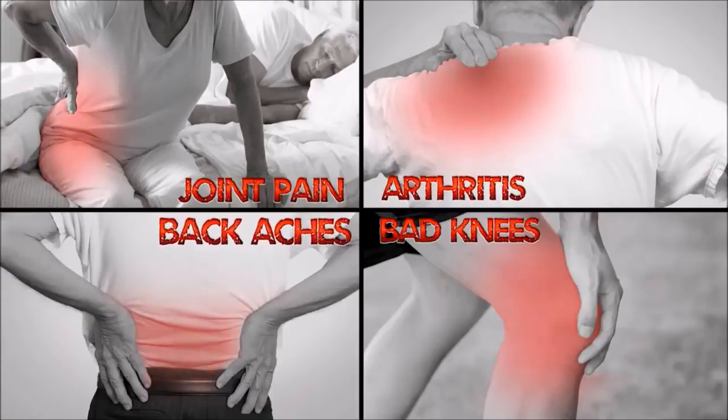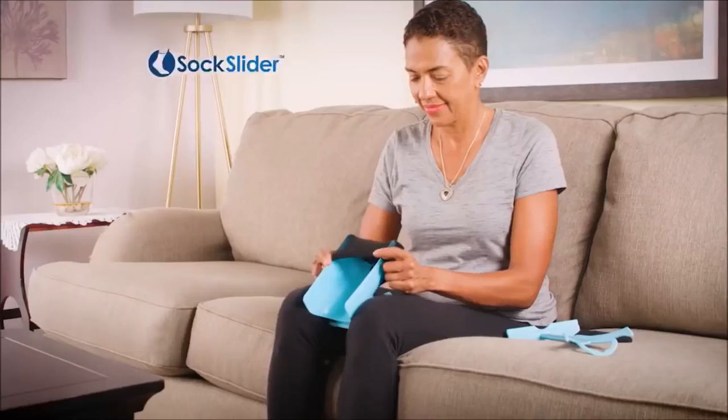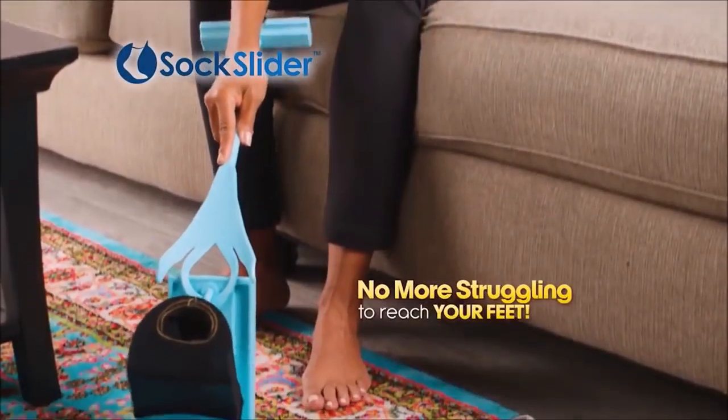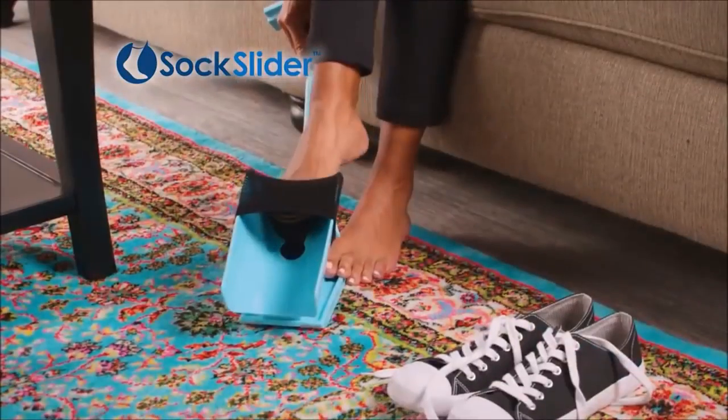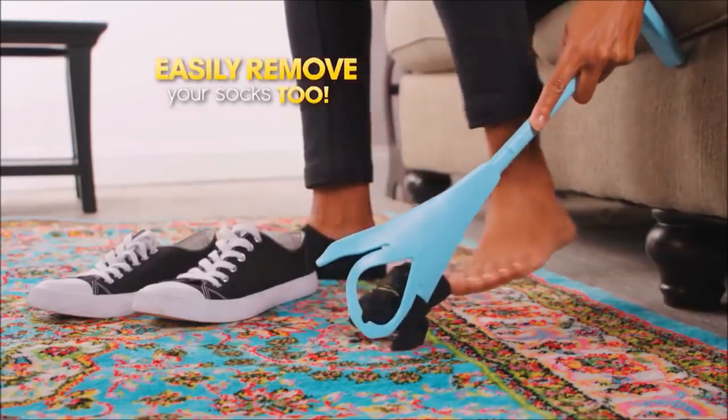Joint pain, arthritis, backaches, bad knees, and surgeries limit your range of motion. But with Sock Slider, there's no twisting, turning, or yearning to reach your feet. One simple step and your socks are on. One quick movement and your socks are off.